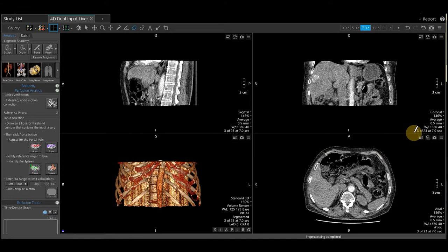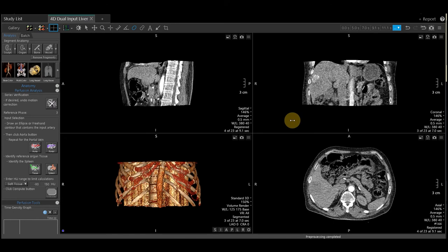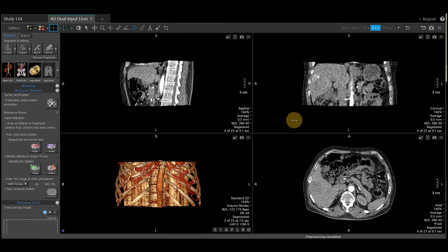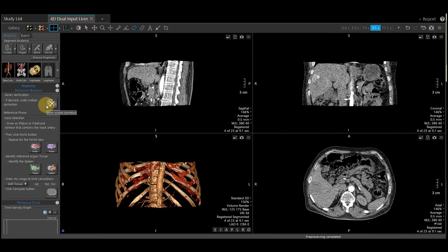As indicated at the bottom right, this is the third phase of 23 phases. Holding your right mouse down and going to your right and to your left will go through the phases that you have obtained. All the tools that you need are located on the left hand side. Under perfusion analysis, you do have the option to undo the motion correction if desired.